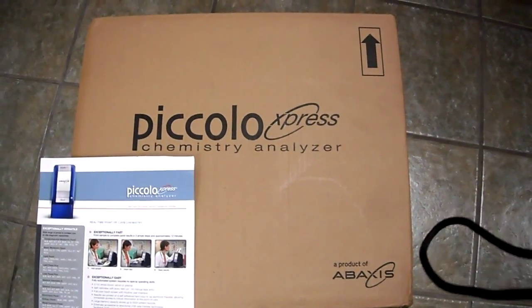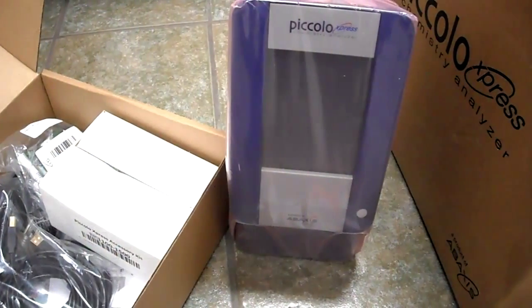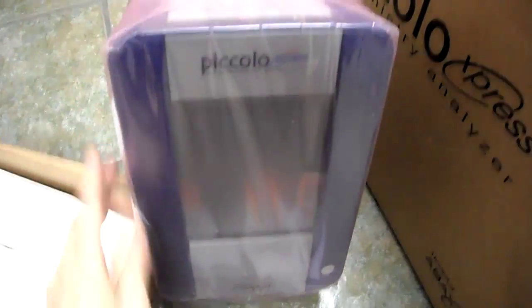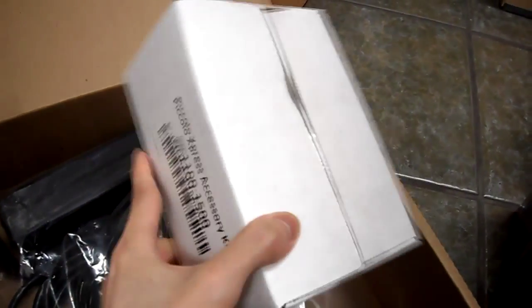You can get results in about 12 minutes, so a lot of my patients will be benefiting from this. Here is the unit itself — if you look at it, it is quite small, very compact, and not too heavy. This is what else comes with it: an AC adapter, an instructional CD, and all that stuff is in there.